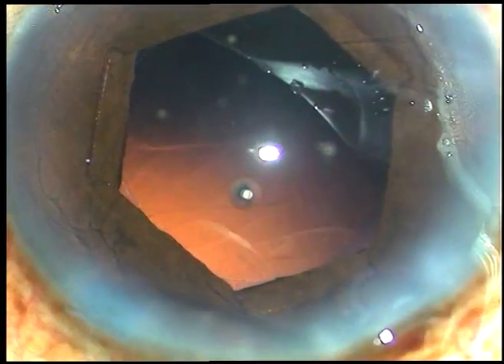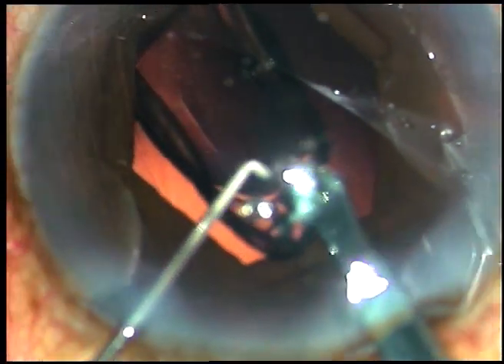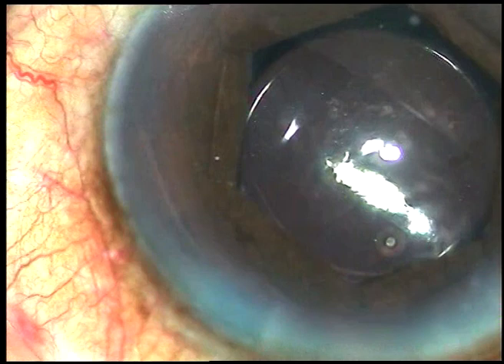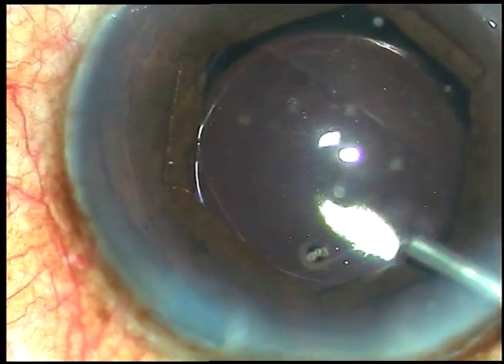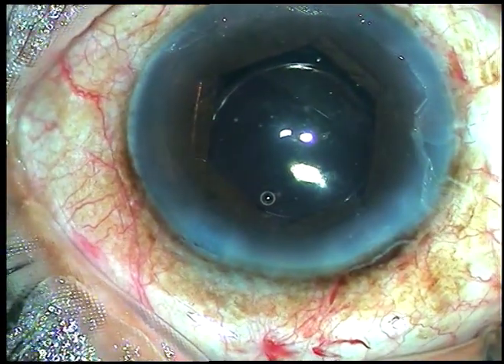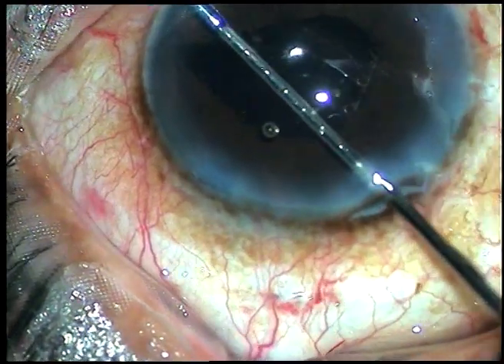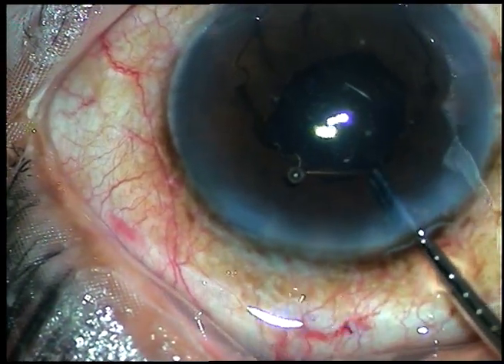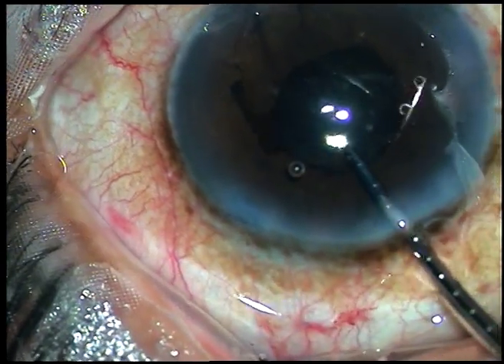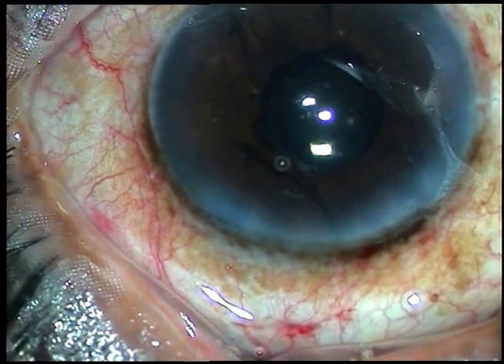Then do cortical cleanup. Now you implant the intraocular lens. Make sure that the lens doesn't cause undue pressure on the flange just in front of the main incision. Gently implant the lens in the bag and now take the 23-gauge forceps again. Hold the flange at 4 o'clock. Untuck all the flanges. Hold it superiorly just in front of the main incision and pull it out. It is so simple. This device doesn't need any injector system.